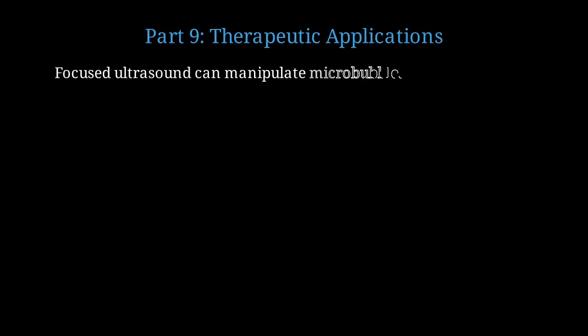Beyond diagnosis, microbubbles enable revolutionary therapeutic applications through acoustic manipulation. High-intensity focused ultrasound can manipulate microbubbles to deliver drugs, open biological barriers, and ablate tissue. First, microbubbles can be loaded with therapeutic drugs or genes and targeted to specific tissues. Drug-loaded microbubbles carry therapeutic payloads through the bloodstream to target sites.